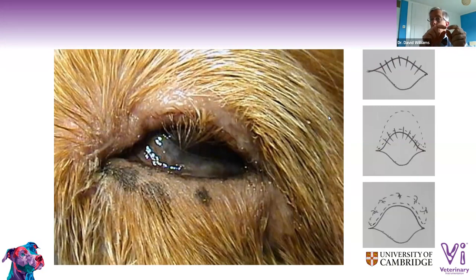so actually closer into the eyelid edge than you would if you were doing a normal Hotz-Celsus procedure for entropion, where you're going half a centimeter away. Here you're going really, really close to the eyelid margin, and then make a big arc here. So we've gone really close inside the edge of the lashes, and then a big arc over here. So that when we sew this down again, I'm not going to sew all of that together. I'm just sewing it. And here I've got some simple interrupteds.